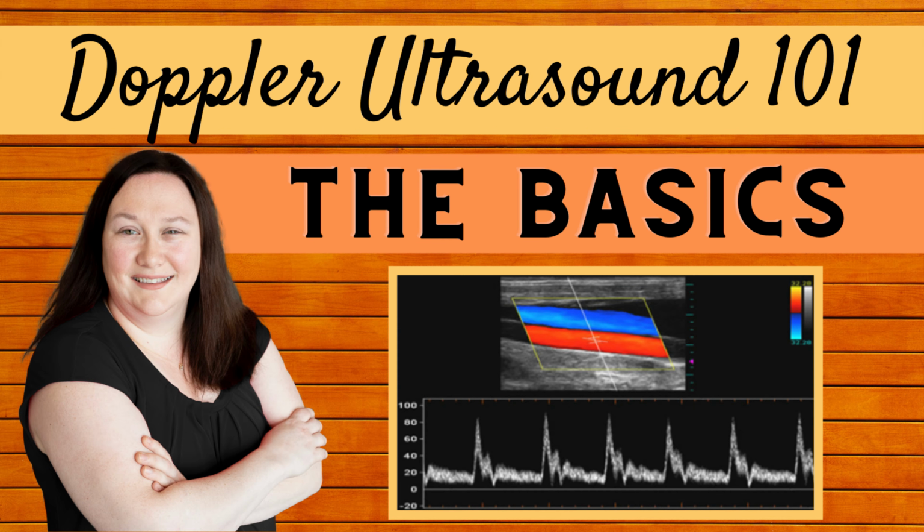On today's edition of Doppler Ultrasound, we're covering Doppler 101, the basics.